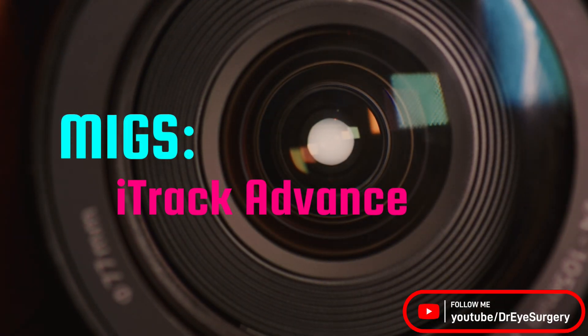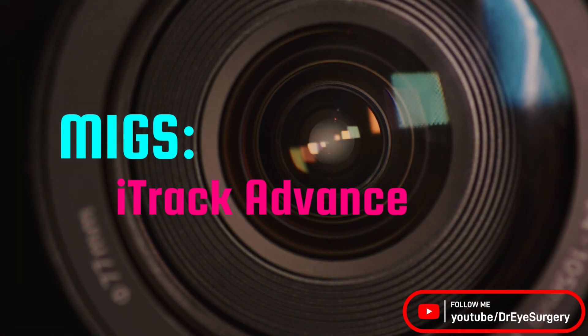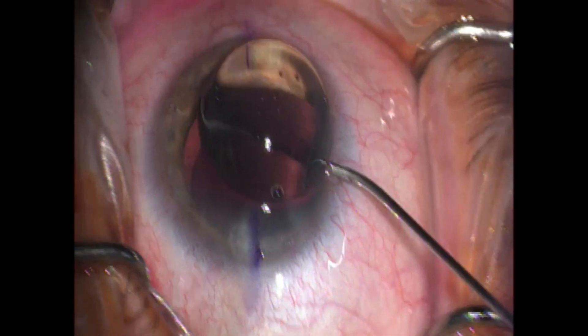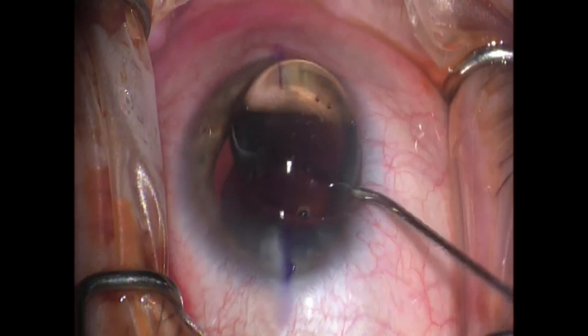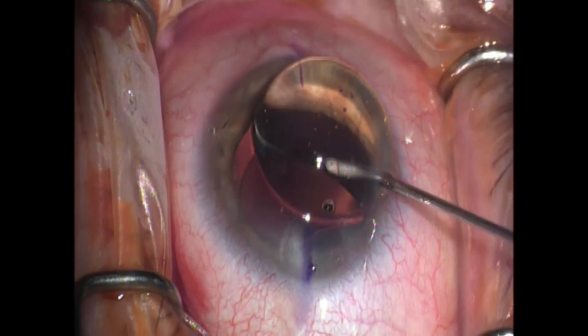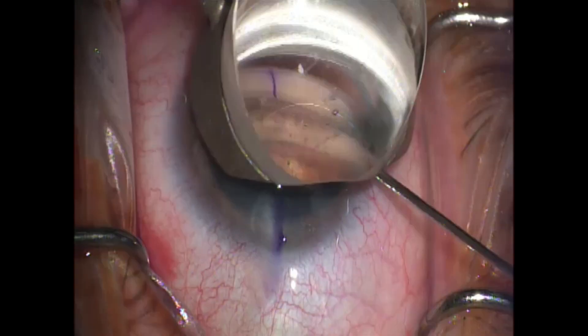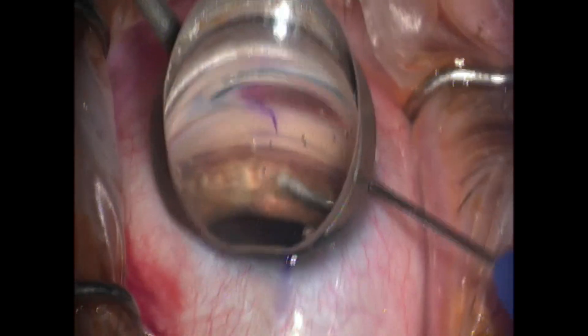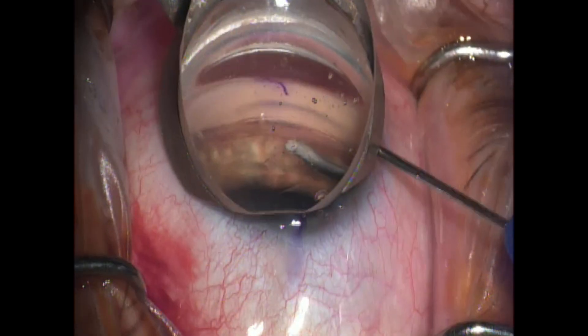Recently I got my hands on the EyeTrack Advance with the intention to upload a video, and here we have a nice demonstration today. A lot of the steps are relatively similar to doing something like an Omni or a Hydrus. You make that extra paracentesis wound, the EyeTrack Advance cannula goes in, and it has a bevel tip there at the top.